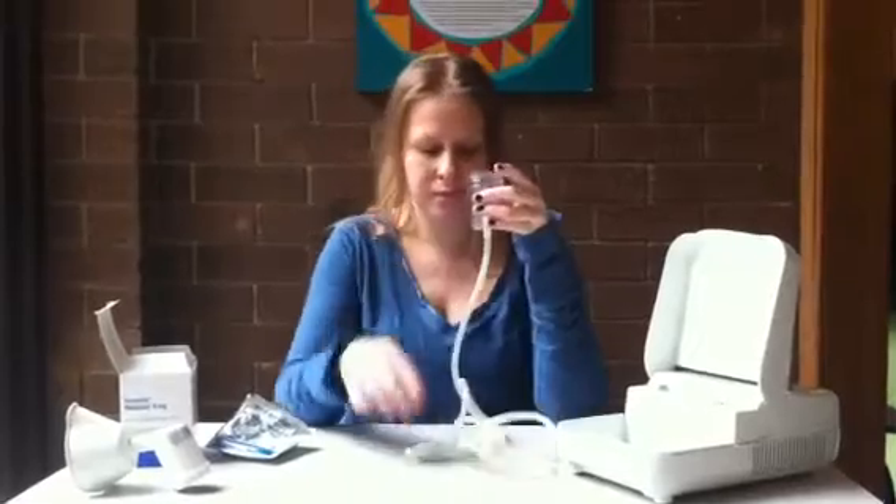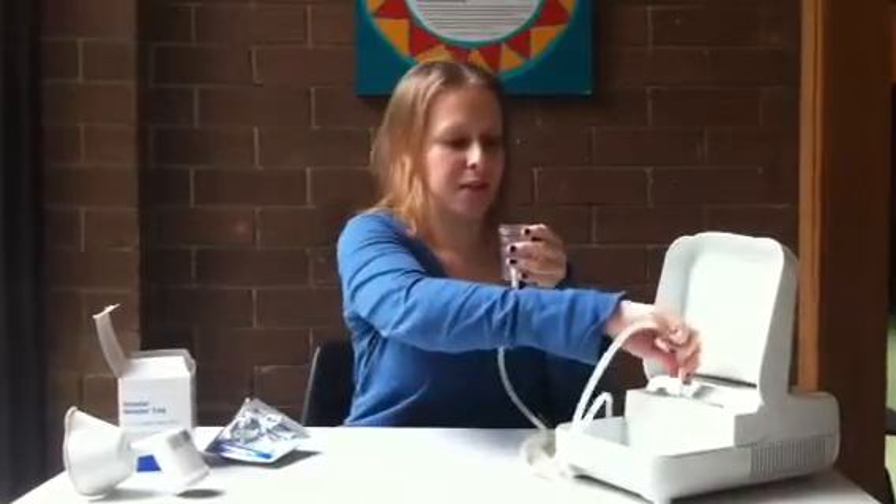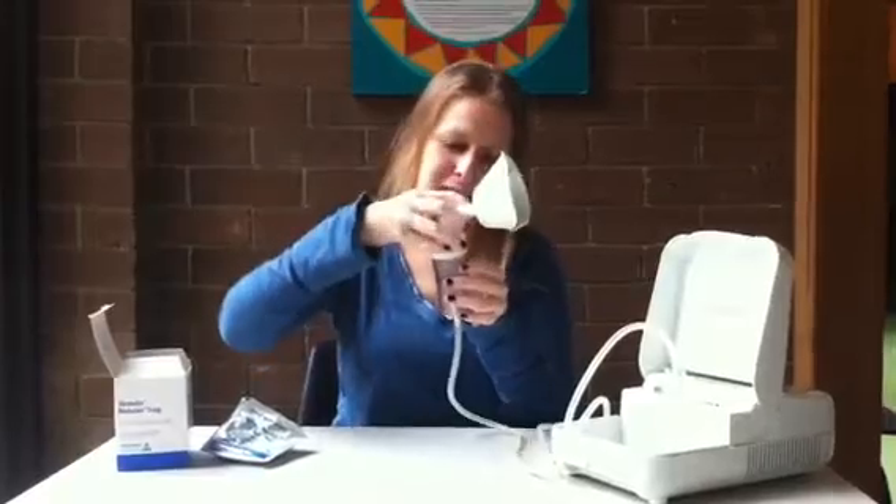Next step: attach the tubing to the bottom of the chamber and the other end onto the nebulizer. Then attach your mouthpiece.